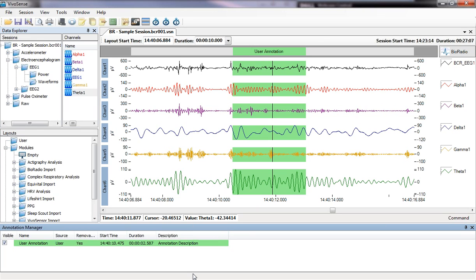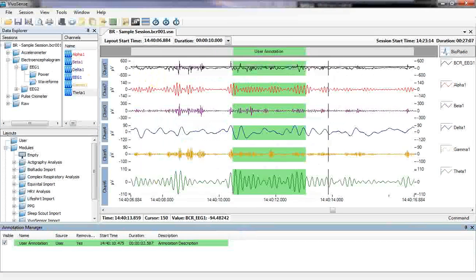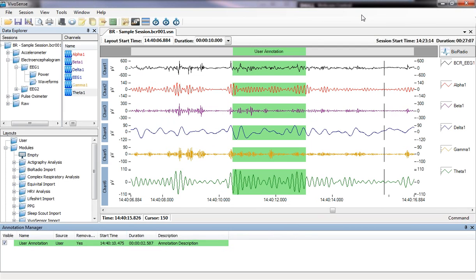So we actually are integrating data from the BioRadio into additional software packages that would allow you to, in a completely automated way, synchronize data that you're collecting with BioRadio with the occurrence of external stimulus, and then being able to monitor the immediate reaction to that with really complete precision timing down to the millisecond level. And that's definitely important when you're talking about EEG research and wanting that very tight time synchronization.